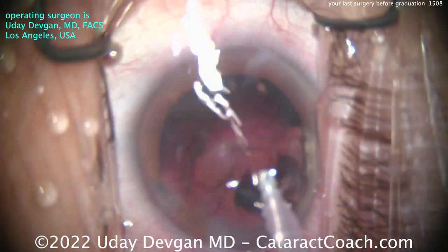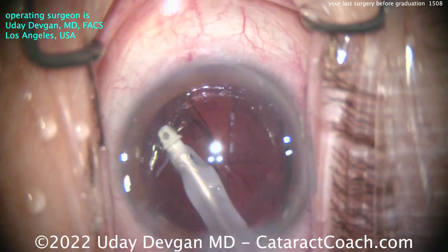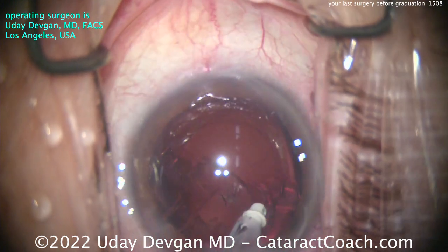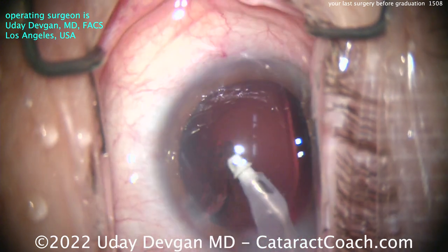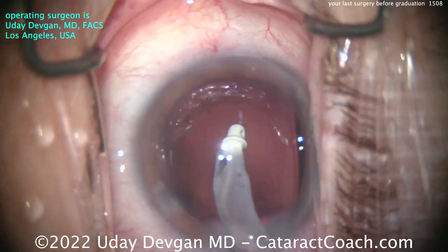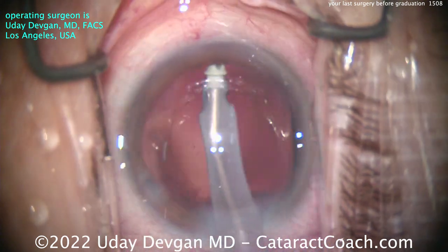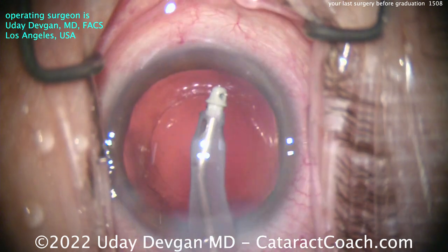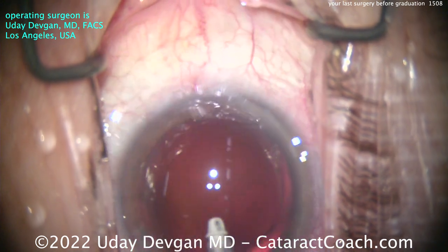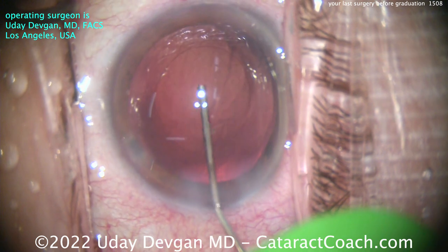At the end, there's a small piece of epinuclear material stuck in the incision. I use some balanced salt solution to push that away, making it easier to grab with our coaxial irrigation-aspiration probe. The eye stays in primary — the only time I don't mind it moving is for the subincisional area, where you need to access it with a coaxial. Nice, clean capsular bag. You've done your homework — the calculations, appropriate measurements for astigmatism. Here's some capsular bag polishing to minimize inflammatory load. That's a really nice-looking rhexis and a totally clean bag.